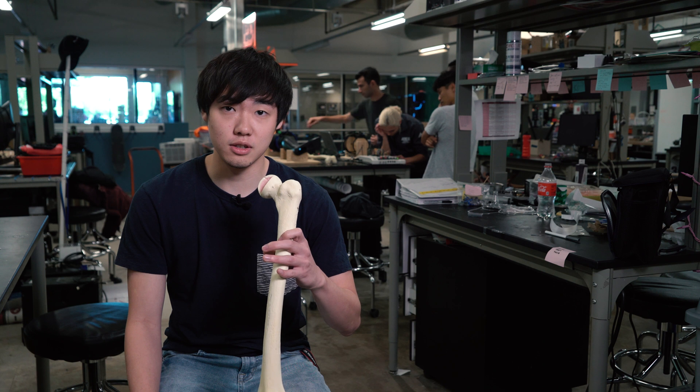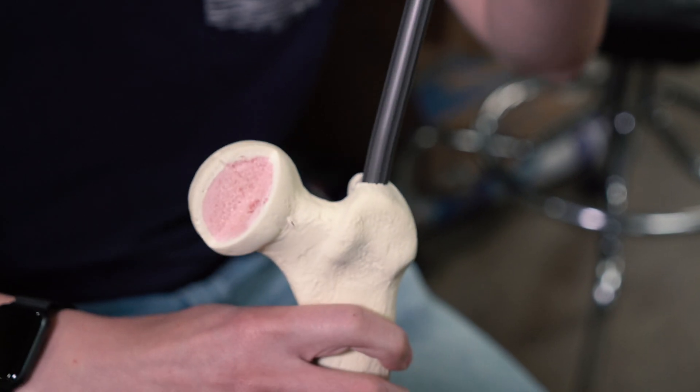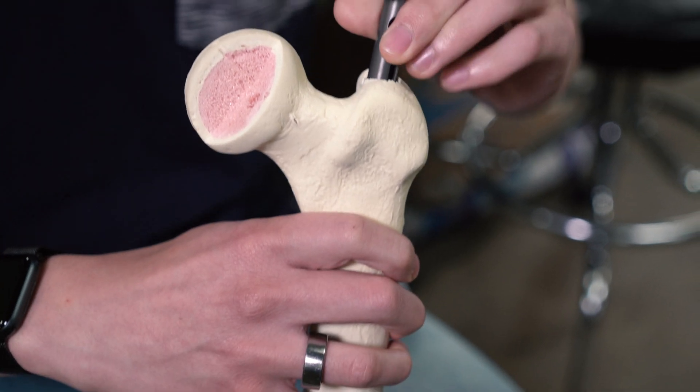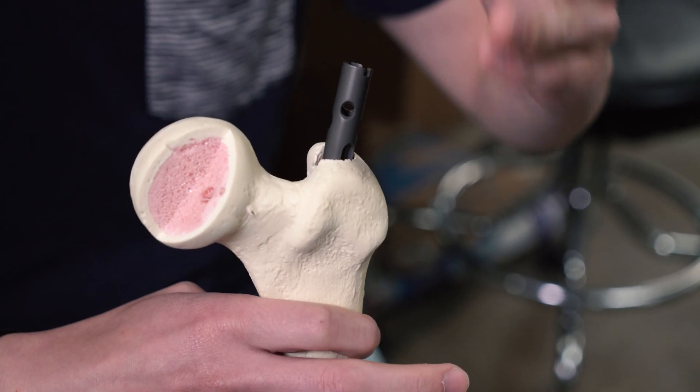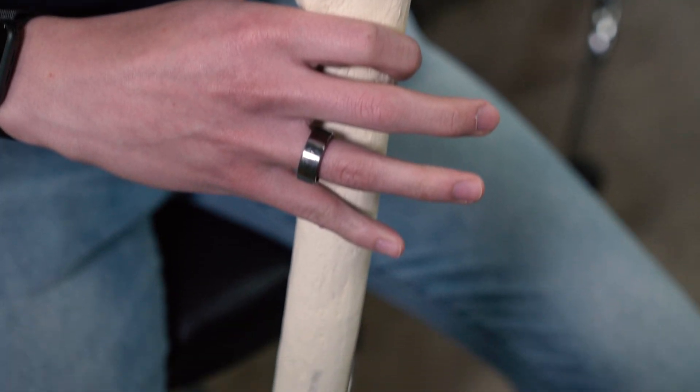When you break your femur, the current procedure is to insert a rod into the bone to align the fracture point. Once the rod is in, they fix it to the bone using screws at the top and the bottom. But to find the screw holes — there are holes in the rod — once you put it into the bone, you can't see them anymore.